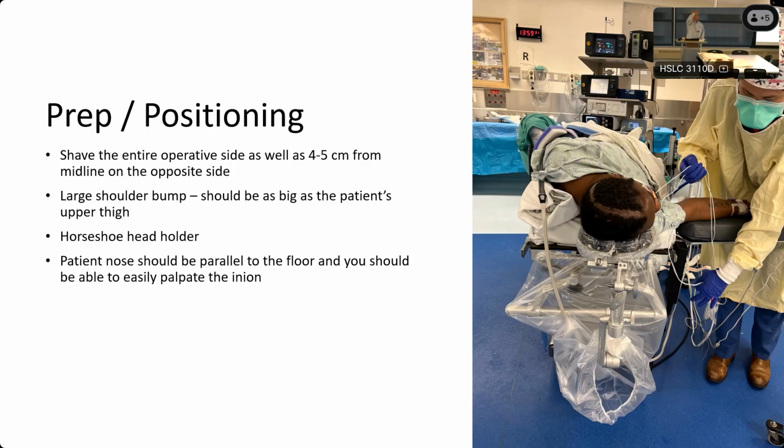I shaved the entire operative side as well as 4 to 5 centimeters from midline on the opposite side. I use a large shoulder bump. I approximate using the patient's thigh for the shoulder bump. I use the horseshoe head holder. I've seen people pin for this.